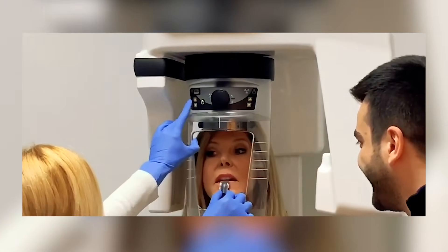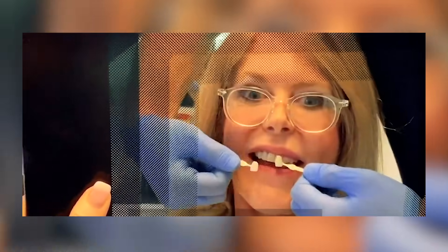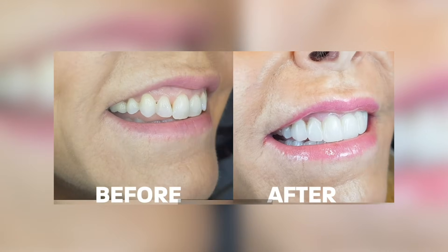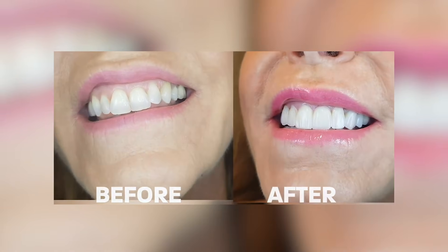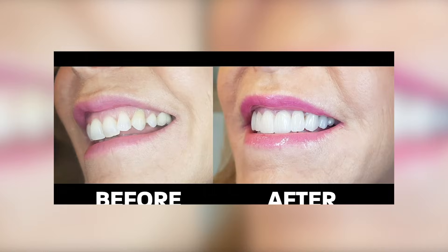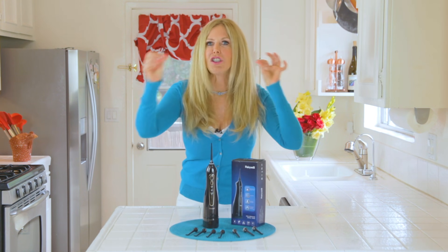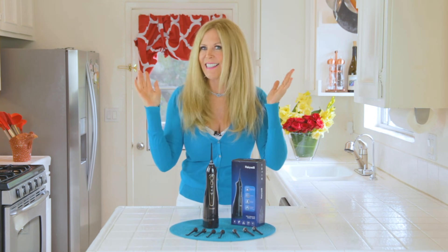I had gone and gotten veneers — you may have recalled that, it was about a year and a half ago. Look at these before and after pictures; it certainly made a big difference in my smile and I'm thrilled with it. But the drawback was I could no longer easily floss my teeth. So I researched the internet because I needed a really good water flosser that was lightweight enough for travel and also for home use.